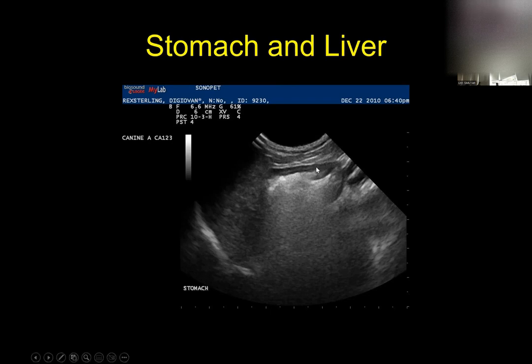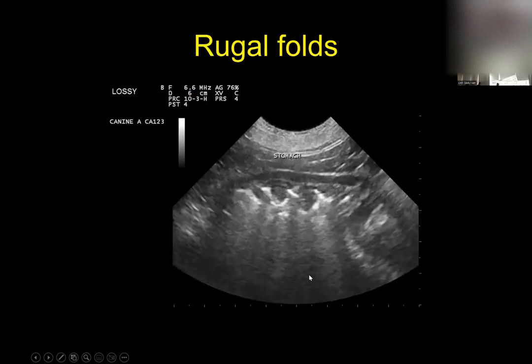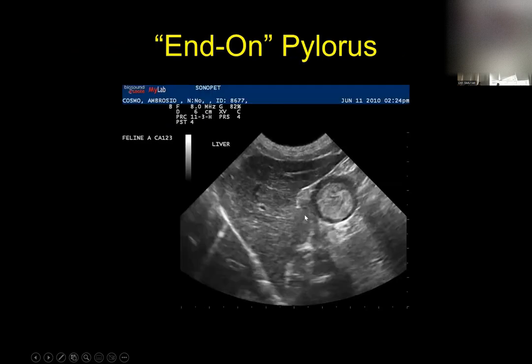Okay. This is an indentation in the stomach. That's a rugal fold. Okay, so that's just a normal rugal fold. You wouldn't want to cheat and measure from the tip of a rugal fold all the way out here. That's cheating. Okay. Again, here's the stomach. The stomach has just a little gas bubble in it. But again, these are prominent rugal folds inside the stomach because there's not much of anything in it. Okay, but again, the layering is well defined around the stomach wall. Same thing here. Well-defined layering, you would measure from here to here thickness, maybe from here to here thickness, but not from here to the tip of a rugal fold. It's a big rugal fold, another big rugal fold. That would be, again, cheating. That's not the right way to do it.